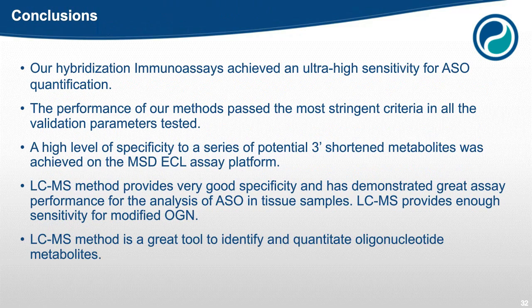Here are our conclusions. Our hybridization immunoassays achieved an ultra-high sensitivity for ASO quantification. The performance of our methods passed the most stringent criteria in all the validation parameters tested. A high level of specificity to a series of potential 3'-end shortened metabolites was achieved on the MSD ECL assay platform.